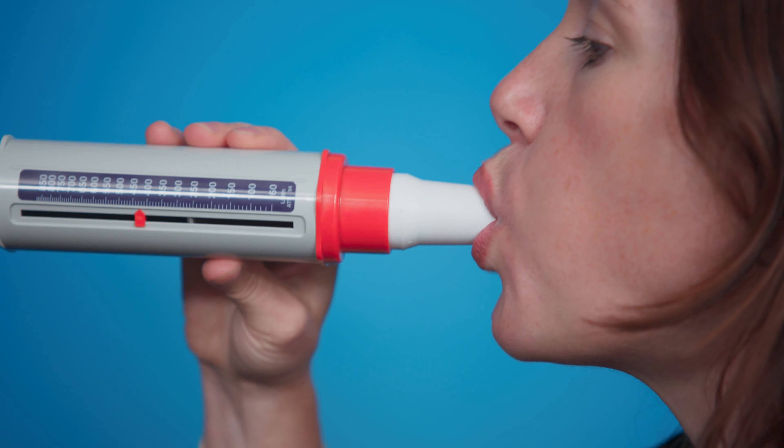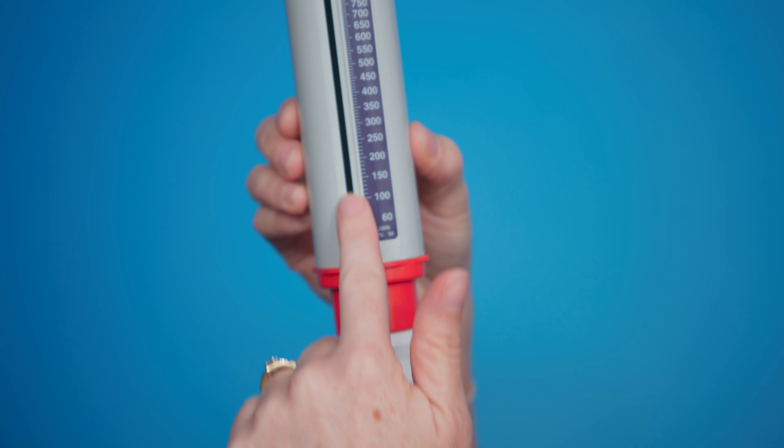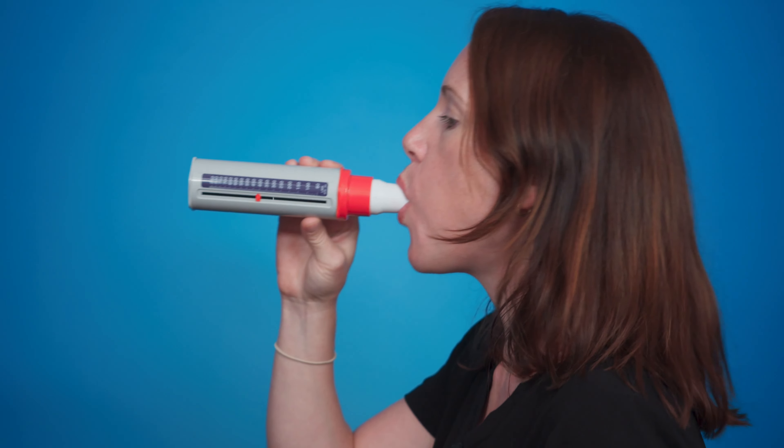You do this three times and take the best out of three, making sure that each time you pop the monitor back down to zero and keep your fingers out of the way of the device as you're blowing.